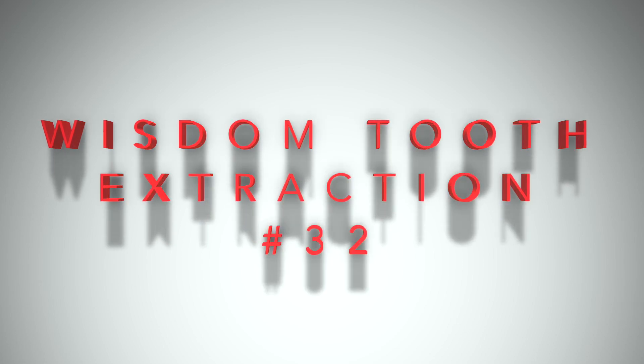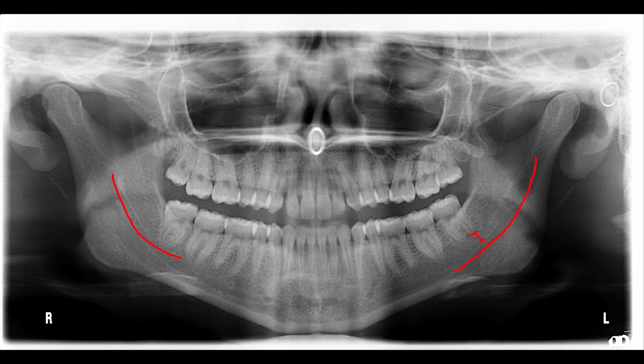Dr. Nguyen here. I want to talk to you a little bit about one technique for a lower third wisdom tooth extraction, tooth number 32.